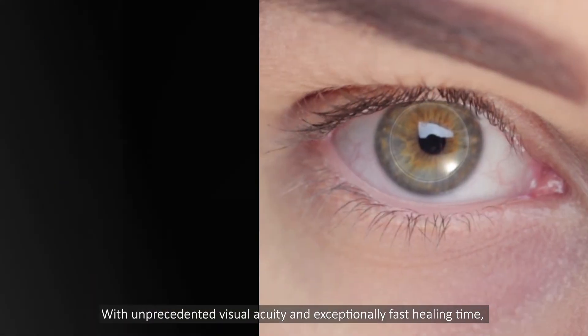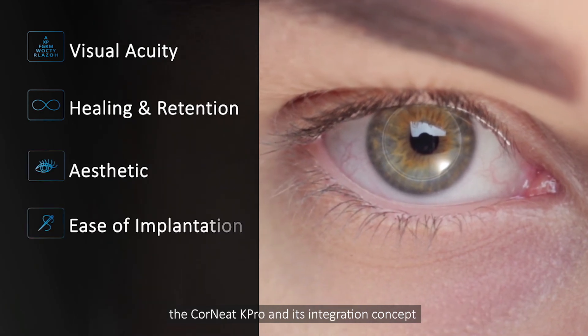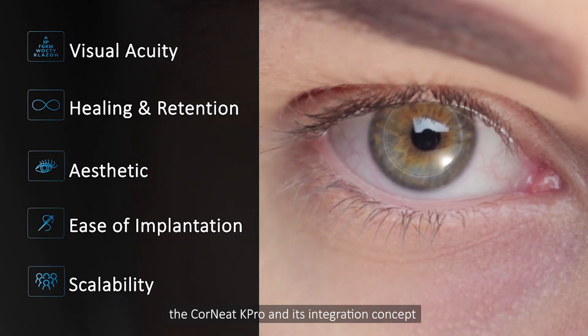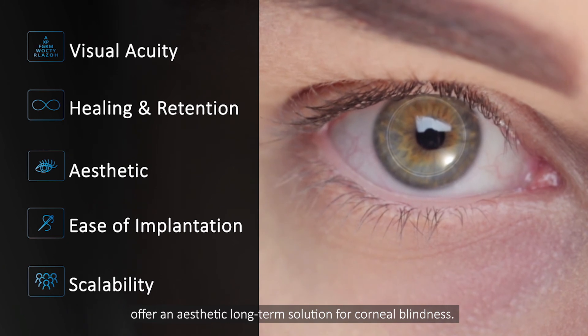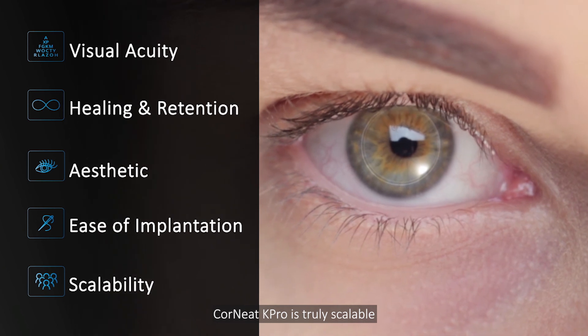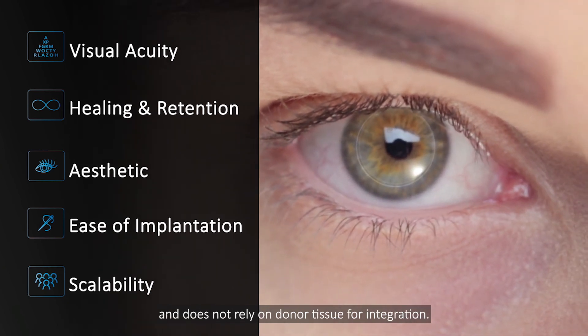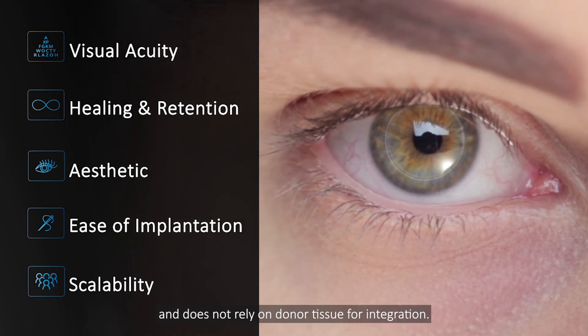With unprecedented visual acuity and exceptionally fast healing time, the Corneat K-Pro and its integration concept offer an aesthetic, long-term solution for corneal blindness. Corneat K-Pro is truly scalable, as it is straightforward and faster to implant, and does not rely on donor tissue for integration.